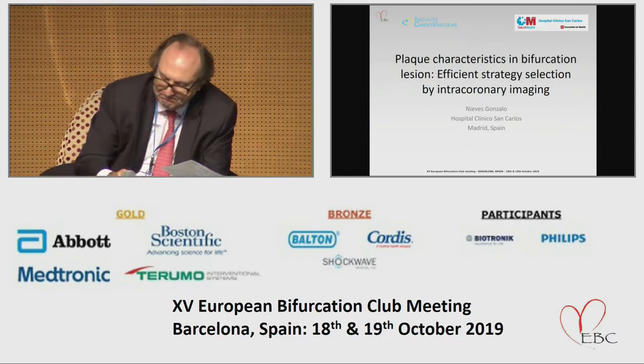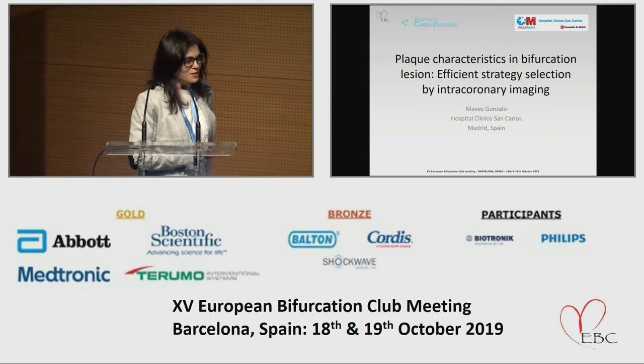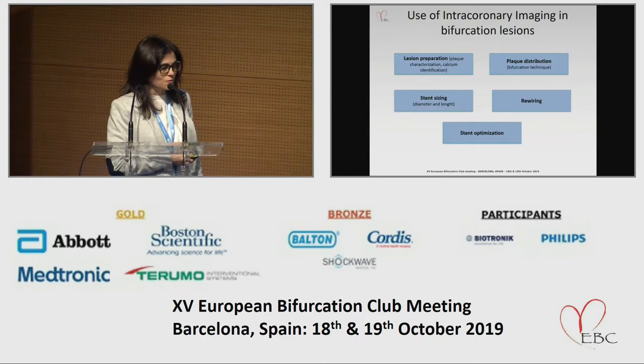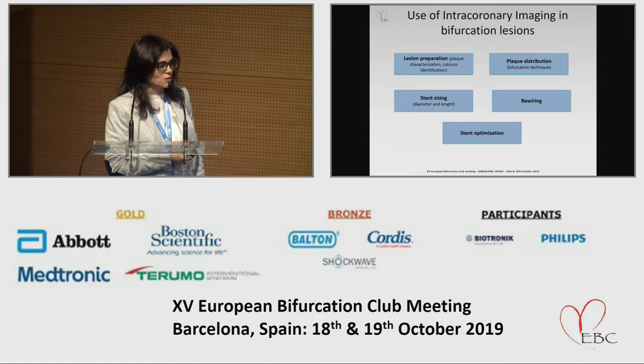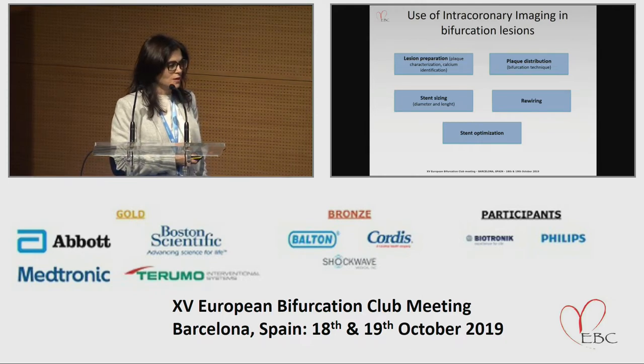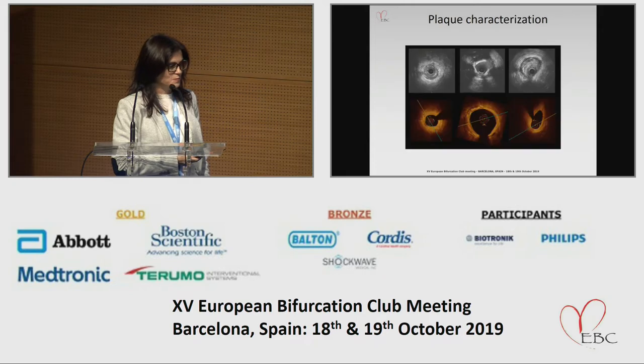Well, good morning, and first of all, thank you very much to the organizers for inviting me to give this presentation. These are all the types of information that we can gain from intracoronary imaging when treating bifurcation lesions. We can have information about plaque characteristics and distribution. We can use it, of course, to size our stents, and also for rewiring and stent optimization. In this talk, I'm going to focus on two aspects: first, plaque characteristics and lesion preparation, and second, plaque distribution to select the stent bifurcation technique.